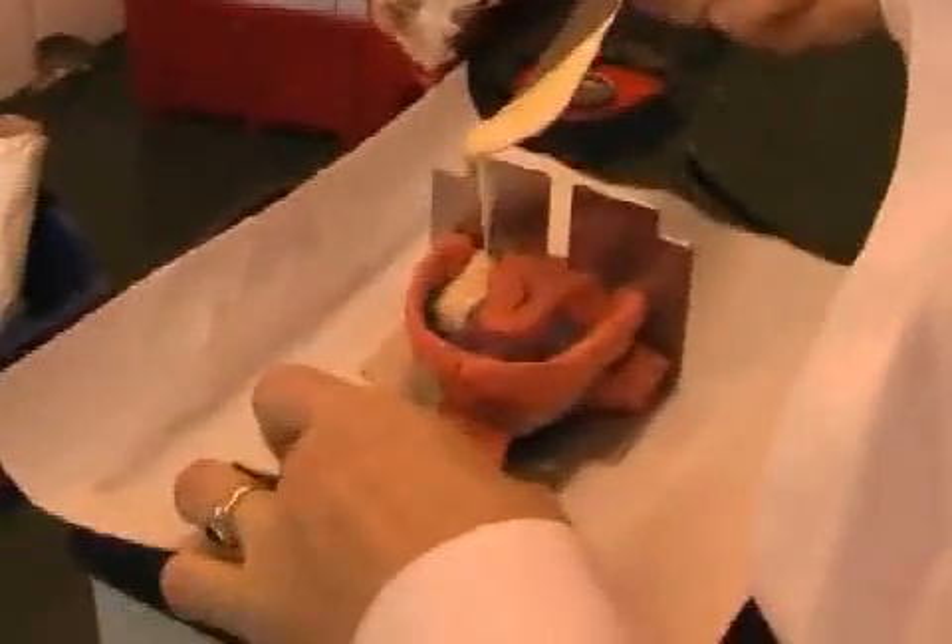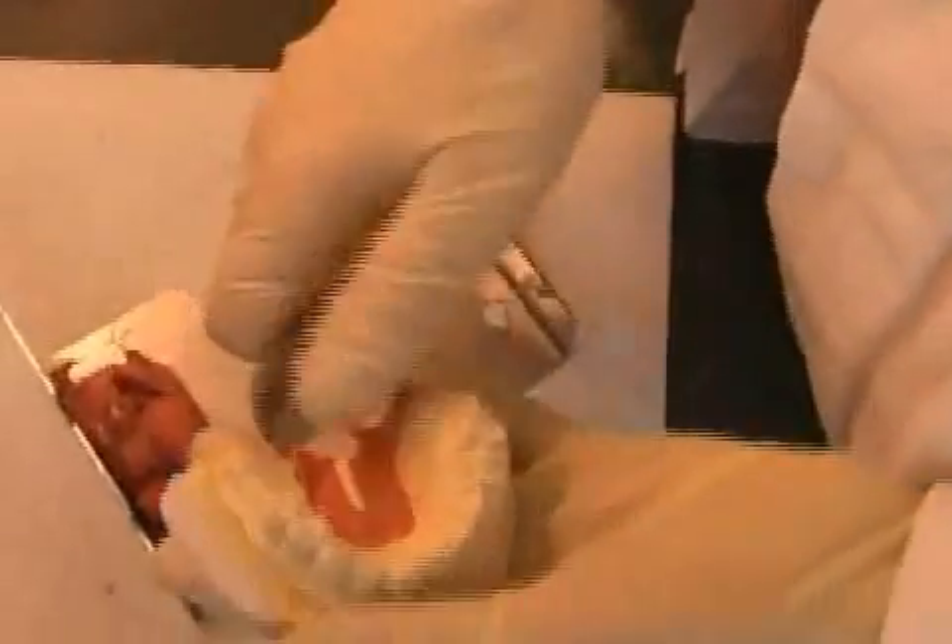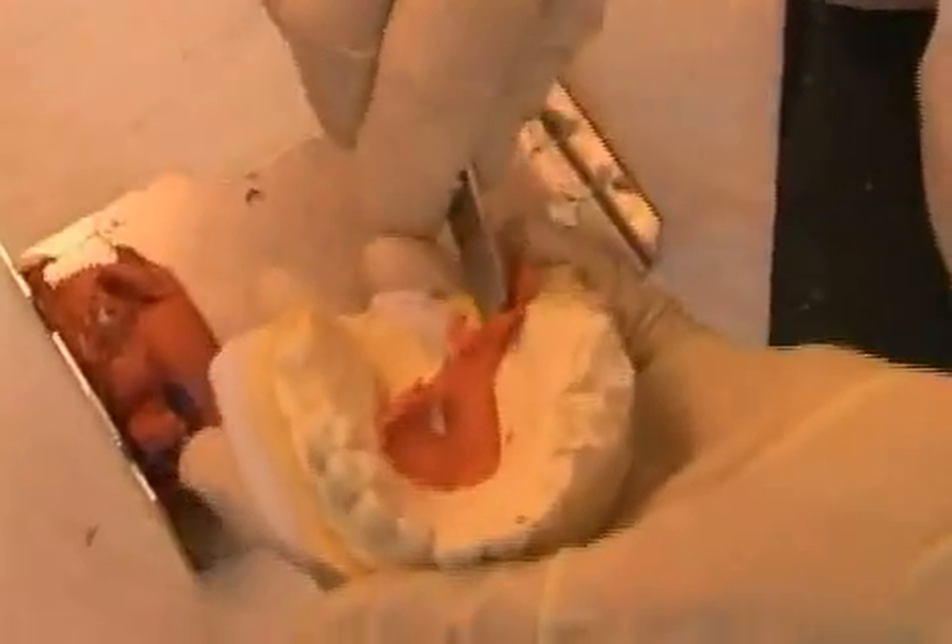Here you can see an imprint of a tooth. The technician pours plaster into it which provides a plaster model of your tooth. The technician prepares the denture based on this model, and the denture should seal tightly around the edges. The preparation edges of the cut should be clearly visible to the technician, meaning that the cast material should be able to flow freely to the edges of the cut.